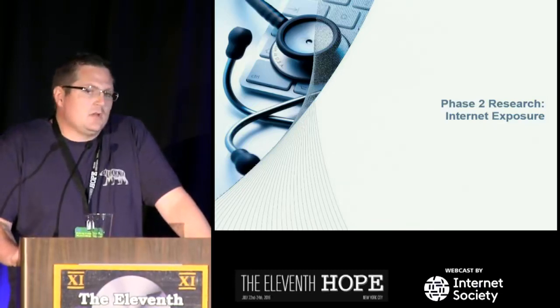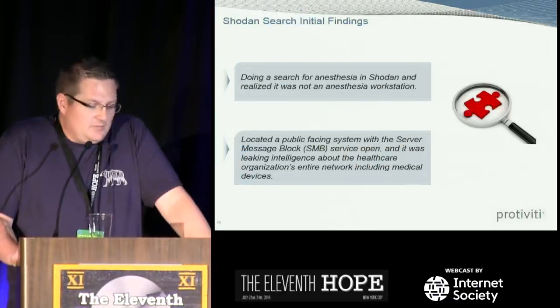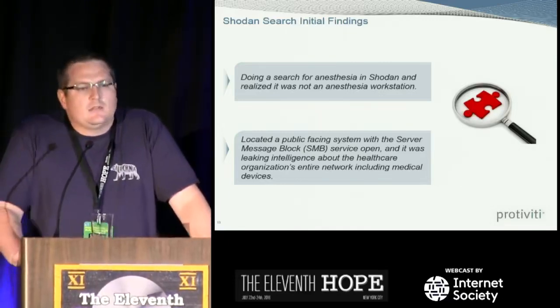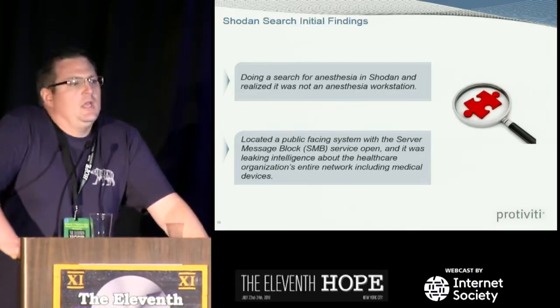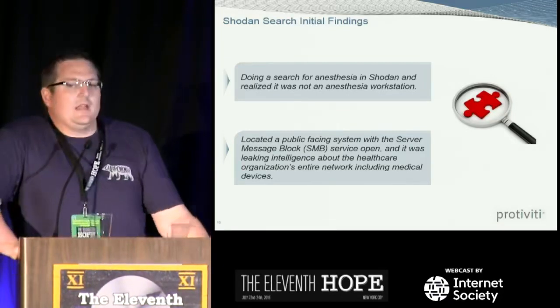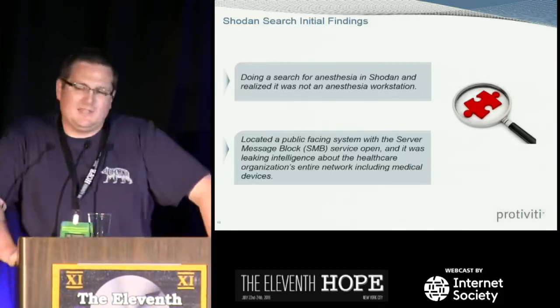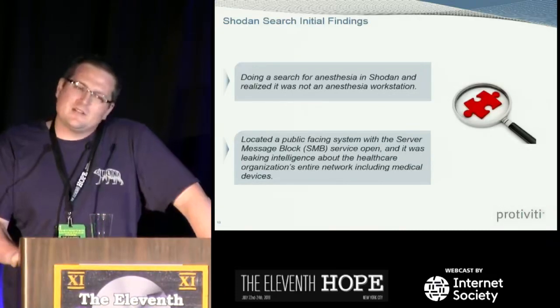So I worked with another researcher, Sean Merdinger, and we ended up looking into Shodan. At first we were doing super elite hacker searches that you'd never think of for medical terms. The one I came up with that was super awesome was "anesthesia," that no one would think of. When we did that, I got a return, and I said, let me look at the system. I've been doing this a while, and I knew this clearly isn't a medical device.